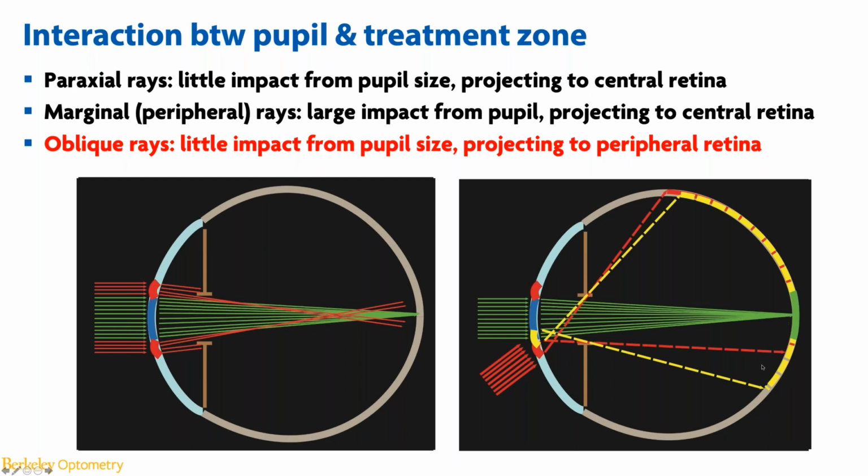So since we haven't fully understood how Ortho-K is working in controlling myopia, simply using one hypothesis to explain a myopia control optimized design at this stage is probably not very sufficient.